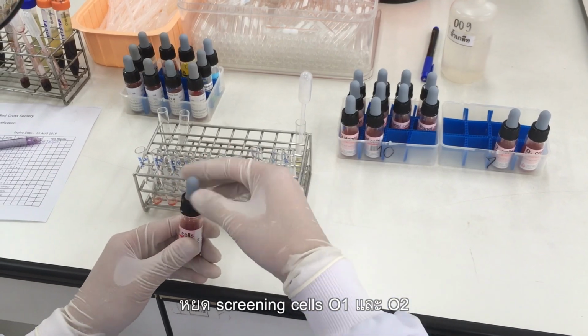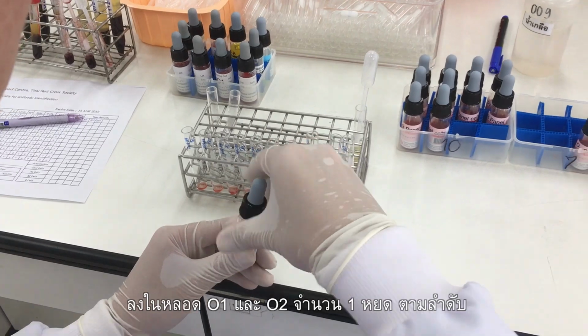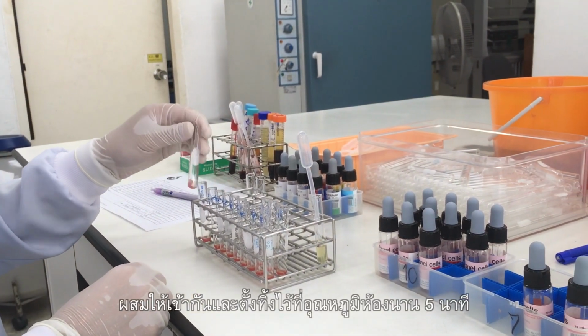Transfer 1 drop of screening cells O1 and O2 into the tubes labeled O1 and O2. Mix and incubate for 5 minutes.